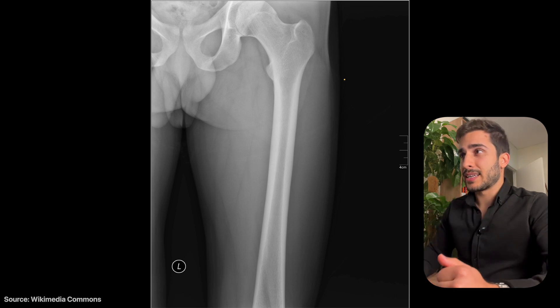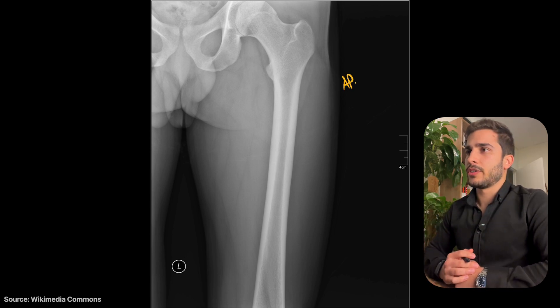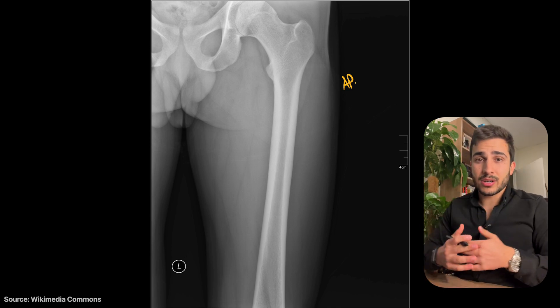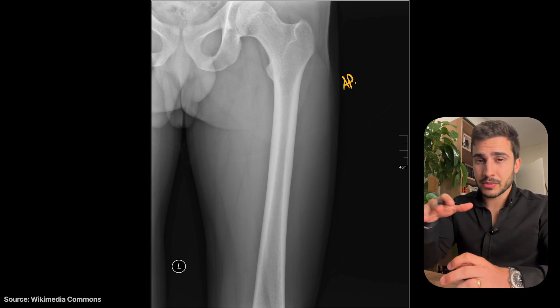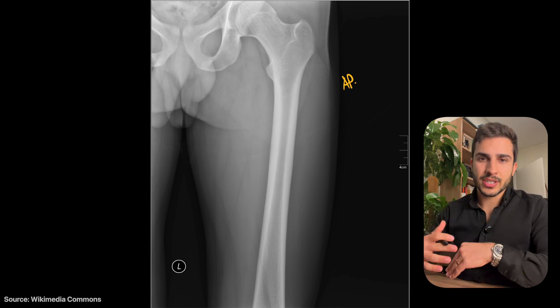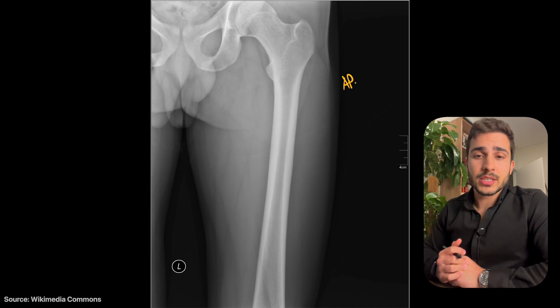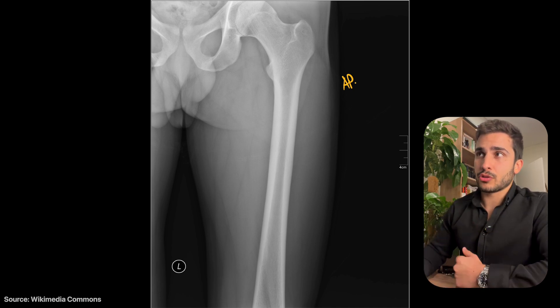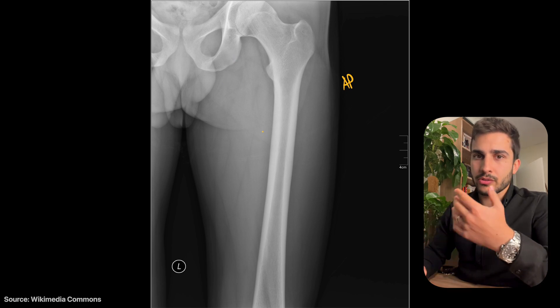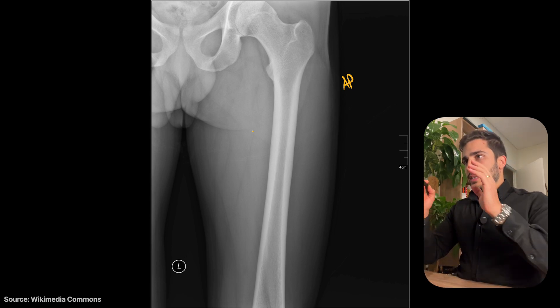Welcome to the first case. We're looking at an AP proximal femur, also known as the hip-down view. Similar to the tib-fib, the femur is one of the longest bones in the body and requires a bucky, so we can't use the diagonal portion of the detector. We often have to image in two segments — the proximal and distal — so most femur x-rays either include the hip joint or the knee joint, with overlap between both AP and lateral views.